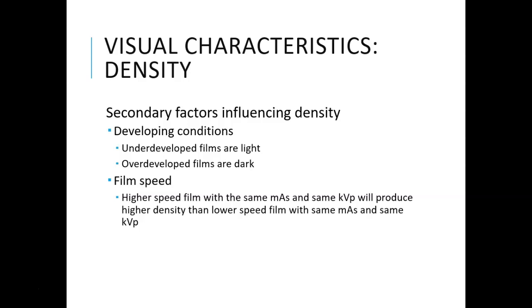Developing conditions. Underdeveloped films are too light, overdeveloped films are too dark, and then there's the speed of the film. Some of this doesn't influence density so much anymore because we are doing digital. But if you go into an office where you're actually developing film, you have to be aware of the temperature of the chemicals, the concentrations, and how old the chemicals are. Maybe you've done that in the past as a dental assistant. That's when these things can truly affect the traditional film and the density.